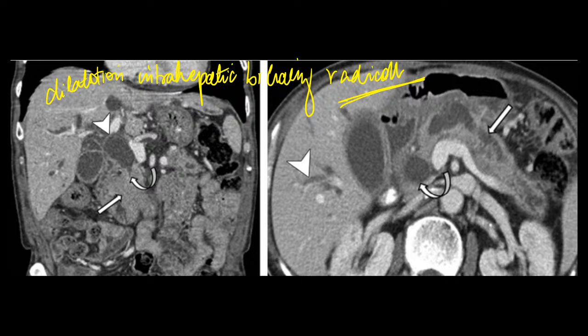Pancreas, okay. Besides that, the pancreas appears normal in size. The pancreas is not swollen, if you are thinking in terms of pancreatitis. What else?